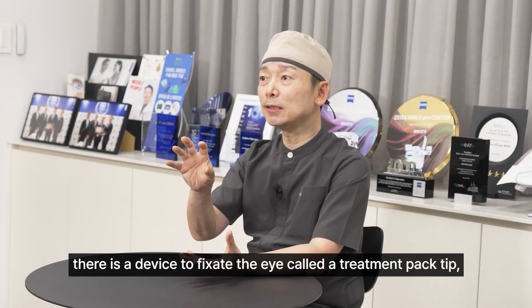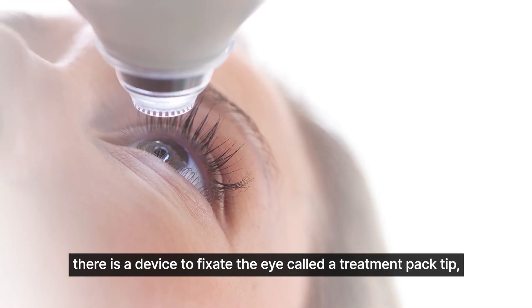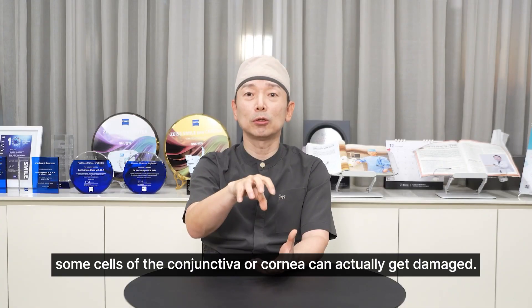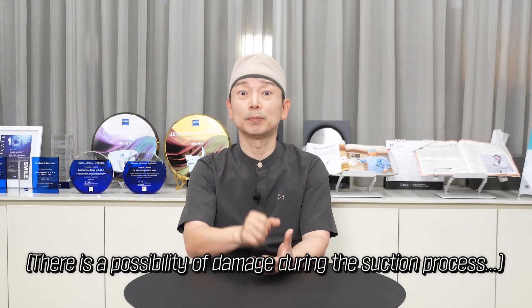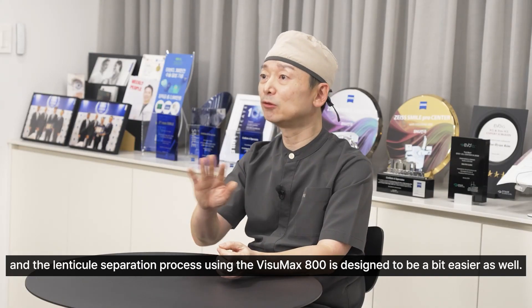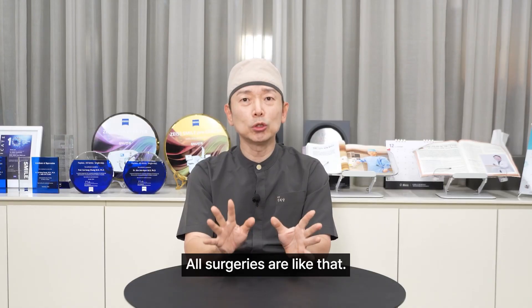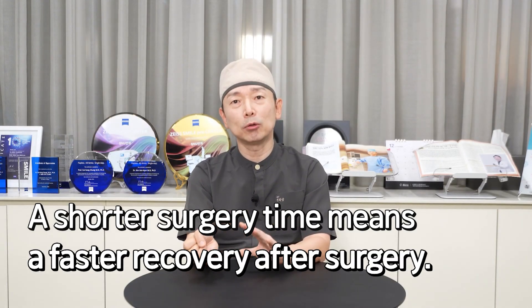When we shoot the laser, there is a device to fixate the eye called a treatment contact tip, which uses suction to hold the eye in place by applying negative pressure. During that process, some cells of the conjunctiva or cornea can actually get damaged. With SmilePro, the suction time is reduced and shorter, and the lenticule separation process using the Visumax 800 is designed to be a bit easier as well. When the surgery time is shortened, it means the recovery is faster.